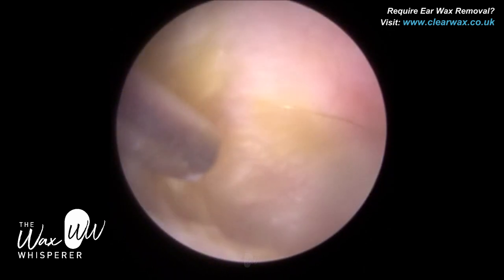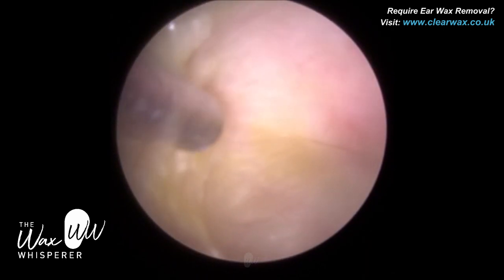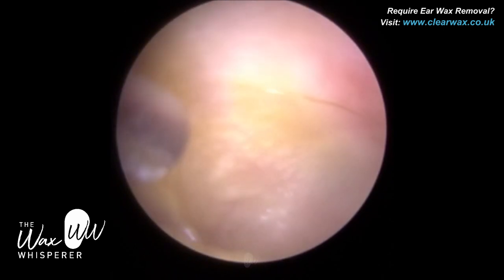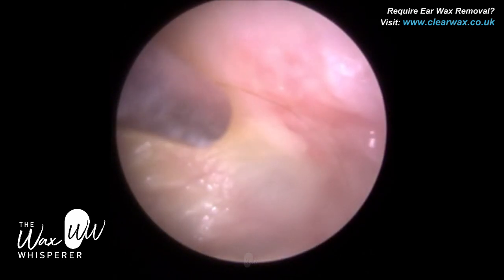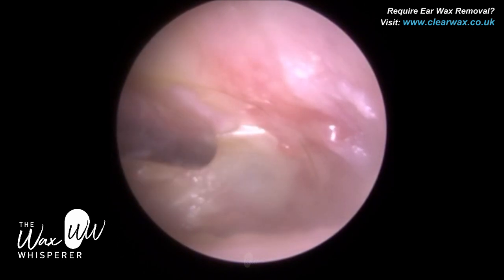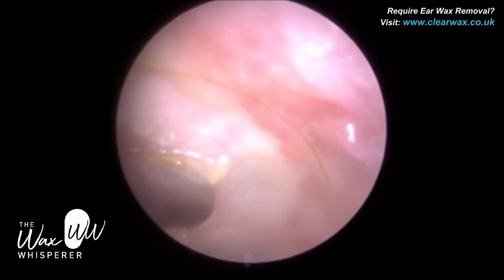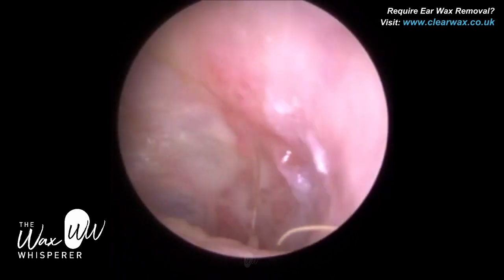Granulation tissue can occur anywhere in the body, but typically within the ear it appears on the eardrum or on the medial ear canal near the eardrum — the bony part. It's part of the healing process. When the eardrum suffers trauma, you can get formation of new connective tissue that can extend laterally out into the ear canal, but also medially into the middle ear. I'm just delicately peeling a layer of dead skin and keratin directly off the eardrum — there's no local anesthesia here, so we have to be very gentle. This granulation tissue has its own blood supply, as you can see.